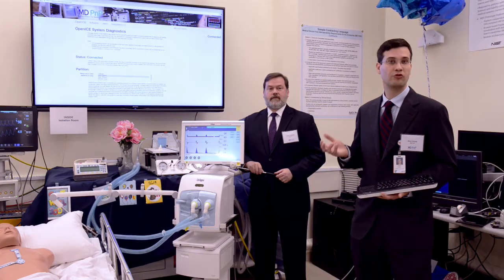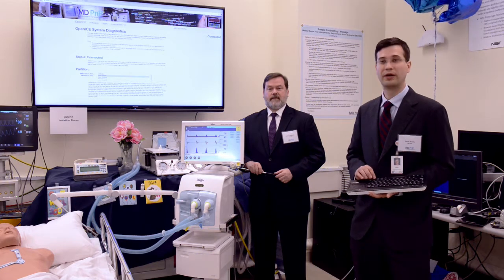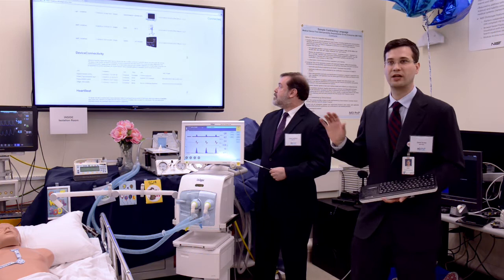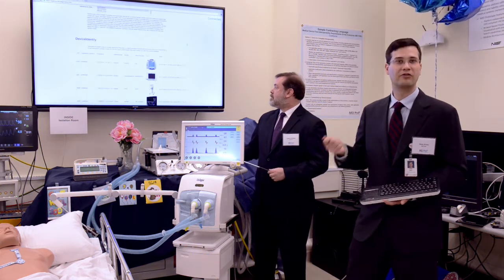What we have here is a diagnostic page for our OpenICE data fabric. A lot of hospital IT departments and biomedical departments really wish that they had one place to look and see all of the data from the devices that's flowing around on their hospital networks. What we've built here is a way of visualizing this. So we see not only what patients are connected, but also the devices that are connected. This is updated live as devices are plugged and played, as they're added and removed.